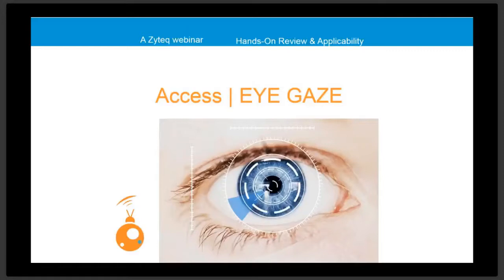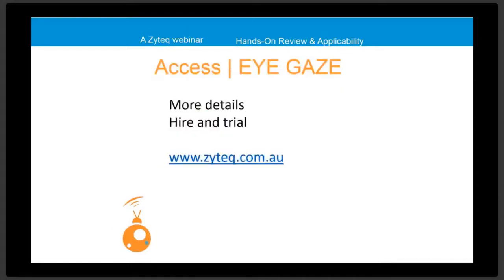So it's usually necessary to try the different cameras and see if one is preferable over another for an individual. It may be that environment has an impact. We find that the IntelliGaze is very accommodating of brightly lit rooms. So you'll most likely be interested to trial a device to be able to compare the different eye gaze cameras.